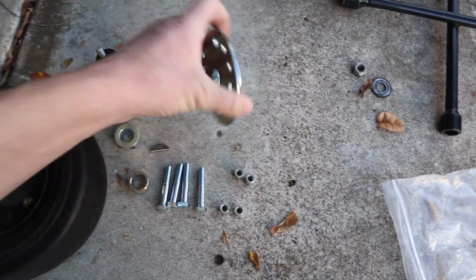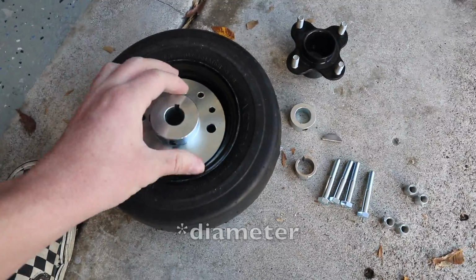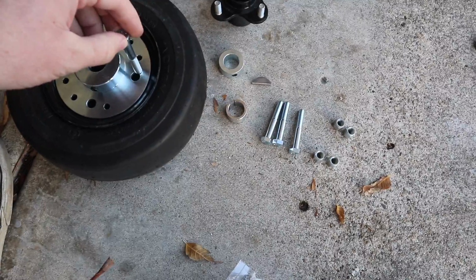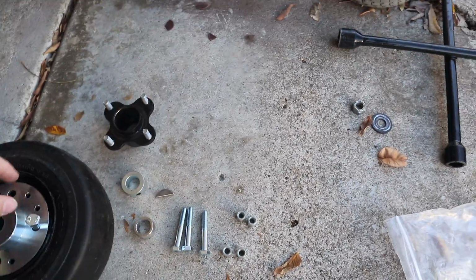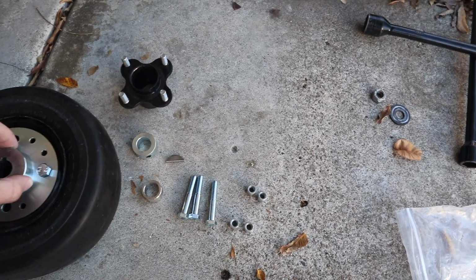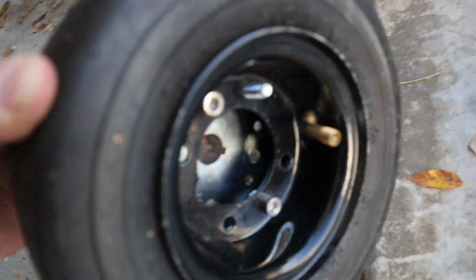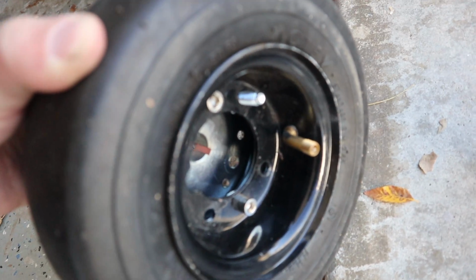to be able to use this hub, because it doesn't sit completely flush because of how big the radius is. So I got longer bolts that fit all the way through, and there we go, it fits all the way through. Then I can thread one of the nuts on there.